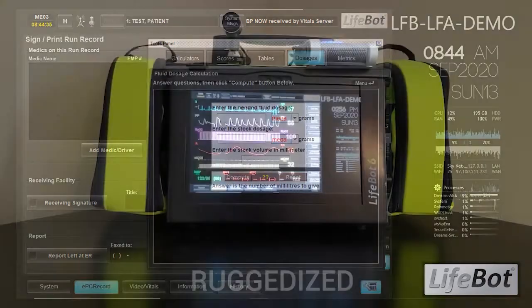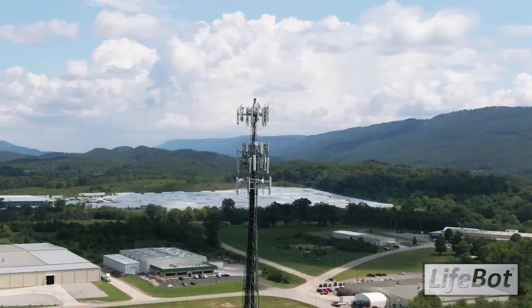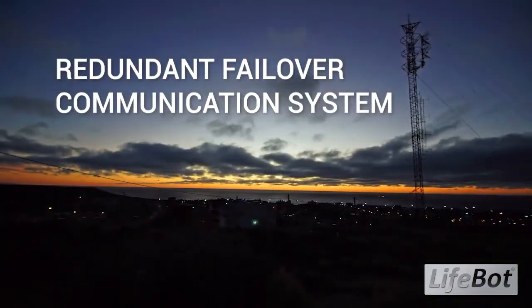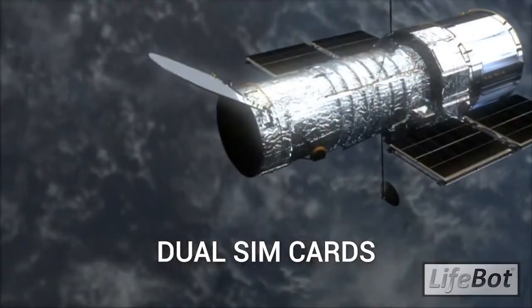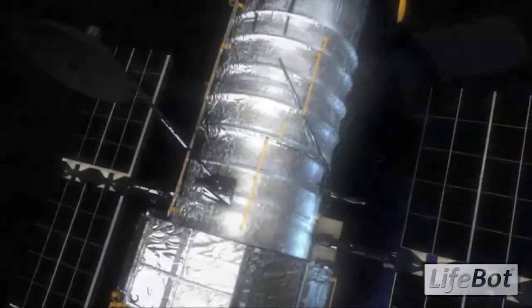The LifeBot contains a ruggedized computer meant to withstand rough handling on the go. The communication system includes automatic failover protection using multiple redundant protocols to maximize the robustness of the connection. The system features dual 4G LTE and 3G SIM cards for data coverage and overage prevention. It also includes external Wi-Fi and GPS antennas.